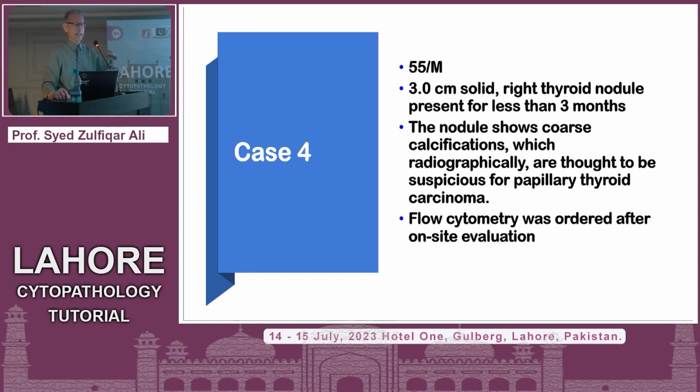So next case is another interesting case. Maybe this is the time that I show you an easy case and not trick you. It's a 55-year-old man with a 3 centimeter solid right thyroid nodule present for 3 months. The nodule showed coarse calcification, which radiographically was thought to be suspicious for papillary thyroid carcinoma.